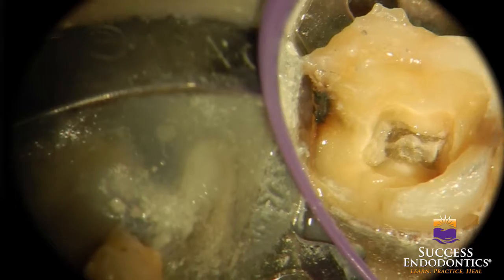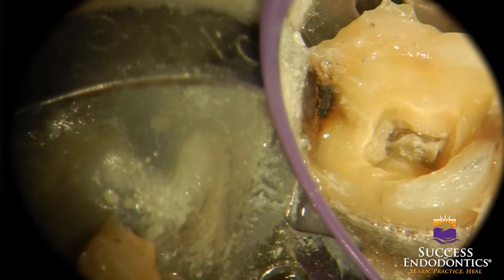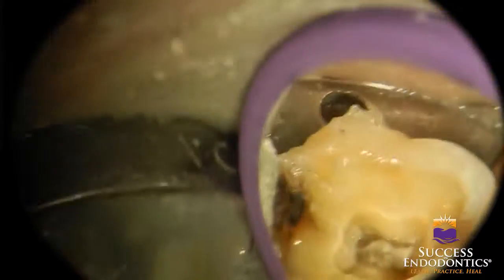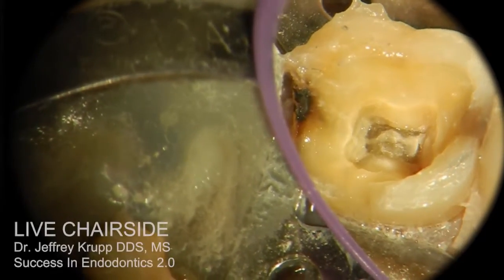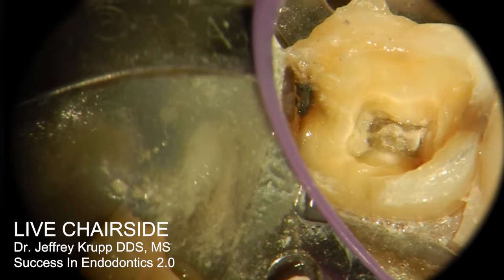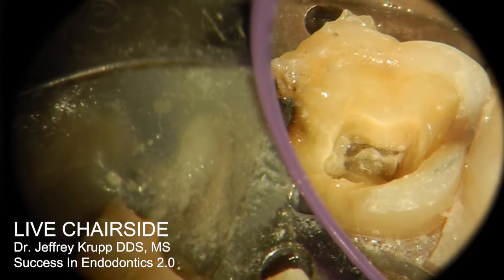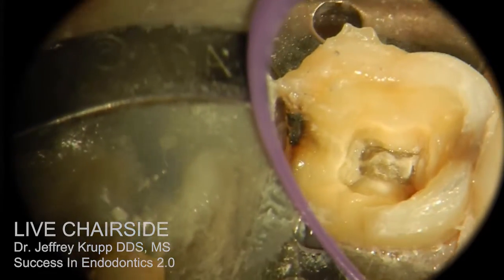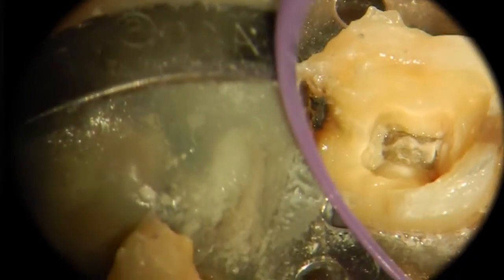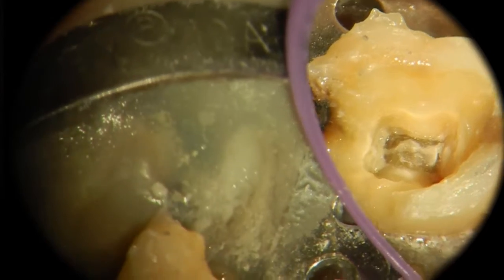Okay, this tooth exhibits a couple of things I like to talk about when we're looking for orifices. One is the wonderful use of the microscope in helping us find canal anatomy. I have a 5-step microscope here, and my macro lens right now is at 0.5, and I'm looking down into the tooth, and I'm going, look, this is nice, but you know, I'm a 63-year-old guy. I want to see a little bit closer, so I'm going to bump this up here.